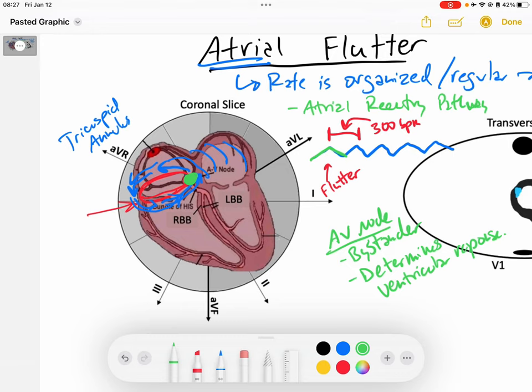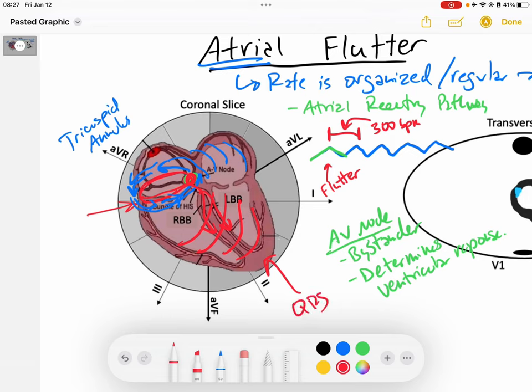When the AV node does conduct, it typically takes the signal and sends it down into the ventricles in a typical fashion. The QRS should really be the same as the baseline — ideally the QRS is not directly influenced by our atrial flutter rhythm.